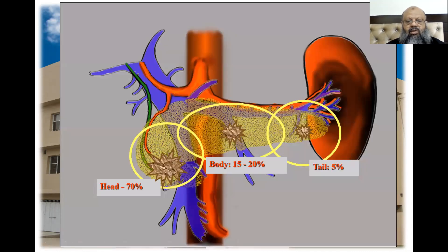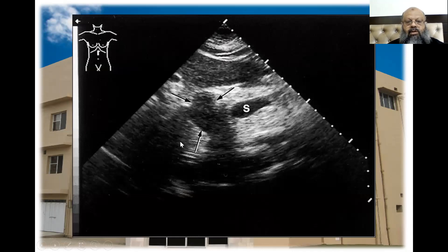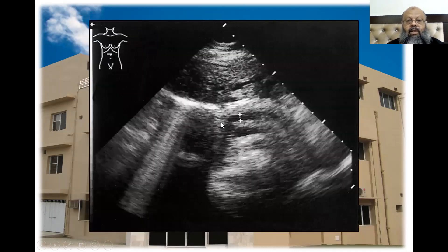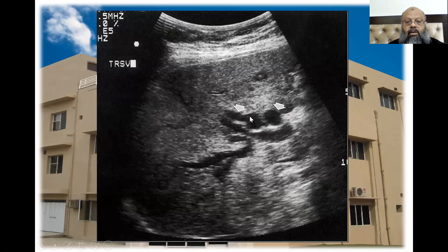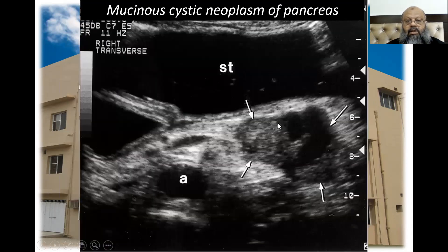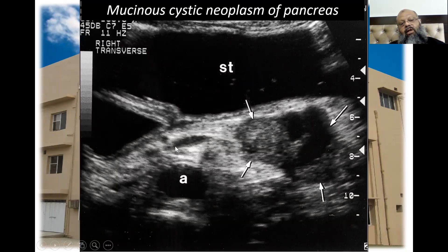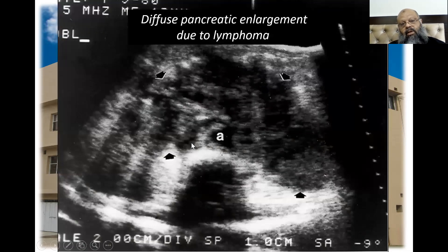Masses of the pancreas can occur at the head, body, or tail — 70% are at the head. This is an example of a mass at the head of the pancreas causing dilatation of the pancreatic duct. You can see the ductal system is disturbed due to it. Here is the stomach, and then we can see a mass with necrotic areas causing dilatation of the pancreatic duct.